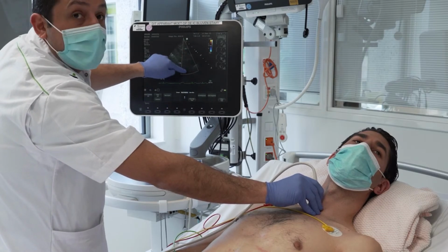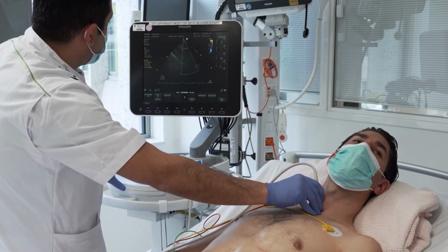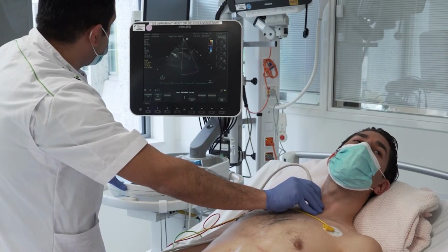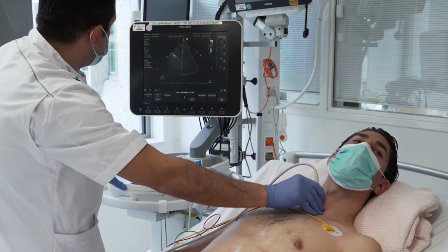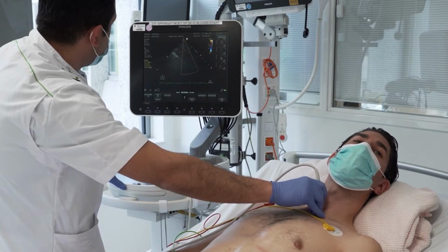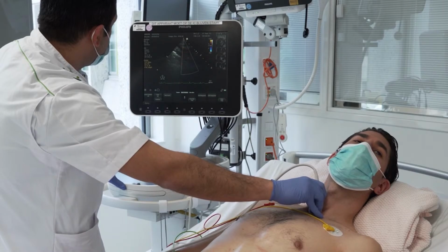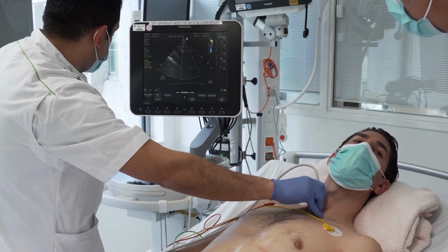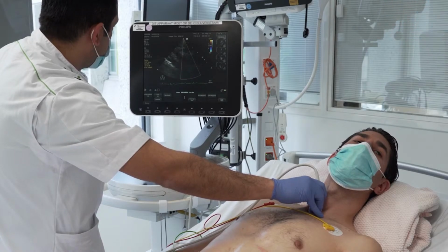So the descending aorta, you can find it. And so just follow a little bit the colors, it can help to detect and locate the aortic arch. And then, oh, that's very nice. You see, Sakir has found the aortic arch, very nice.